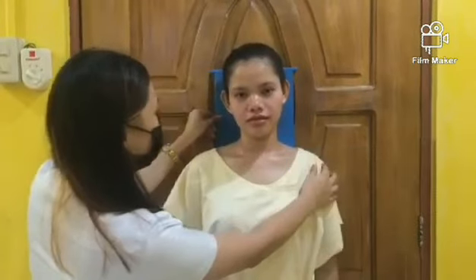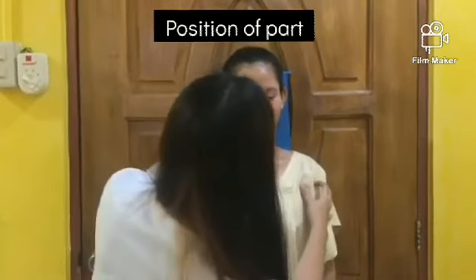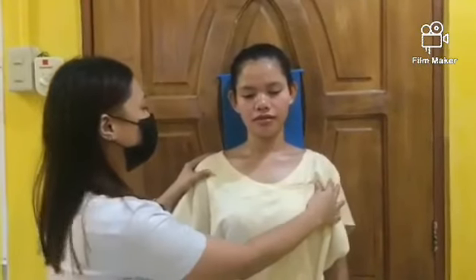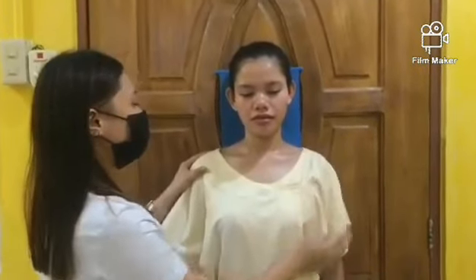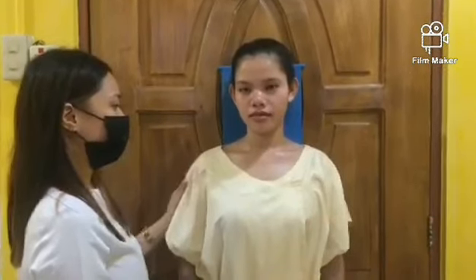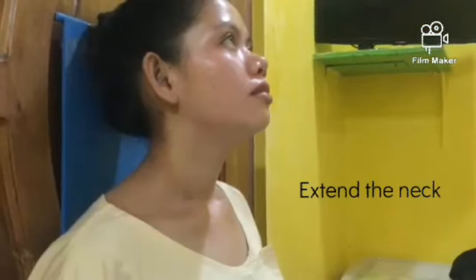So we're going to center the mid-sagittal plane of the patient's body to the midline of the table or vertical grid device. Adjust the patient's shoulders to lie in the same transverse plane to prevent rotation. We have to extend the neck enough to place the occlusal plane and mastoid tips in the same transverse plane to prevent superimposition of the mandible and the mid-cervical vertebrae.